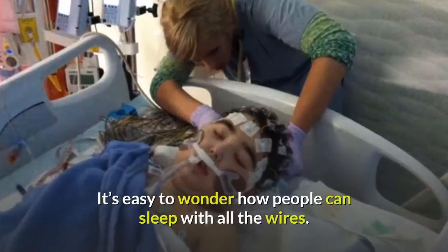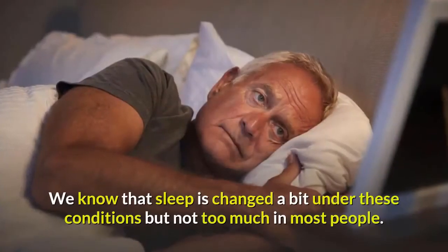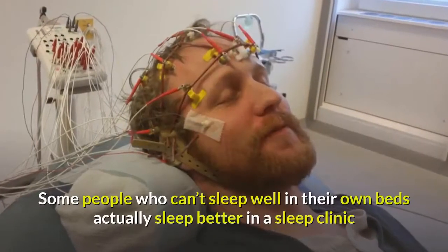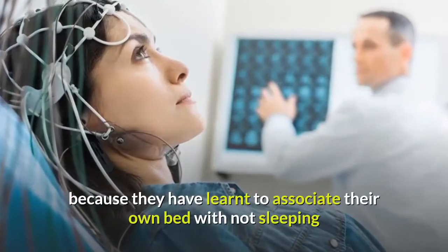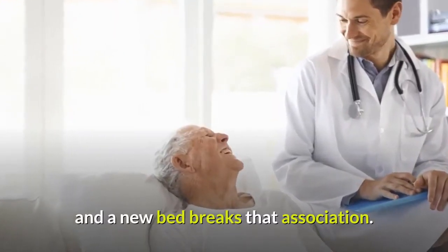It's easy to wonder how people can sleep with all the wires. We know that sleep is changed a bit under these conditions, but not too much in most people. Some people who can't sleep well in their own beds actually sleep better in a sleep clinic because they have learned to associate their own bed with not sleeping, and a new bed breaks that association.